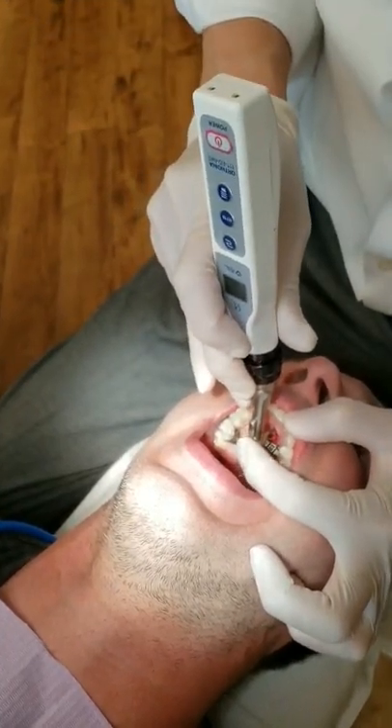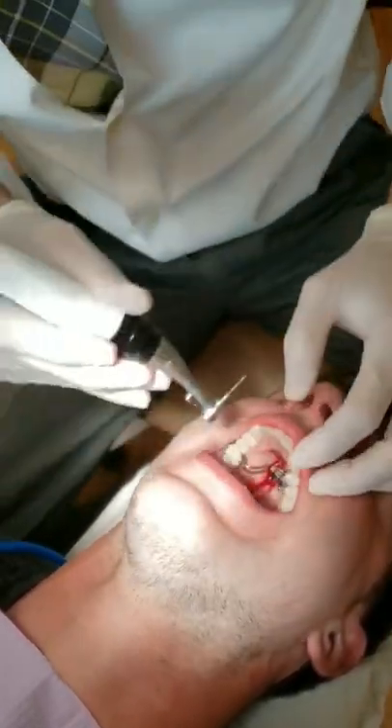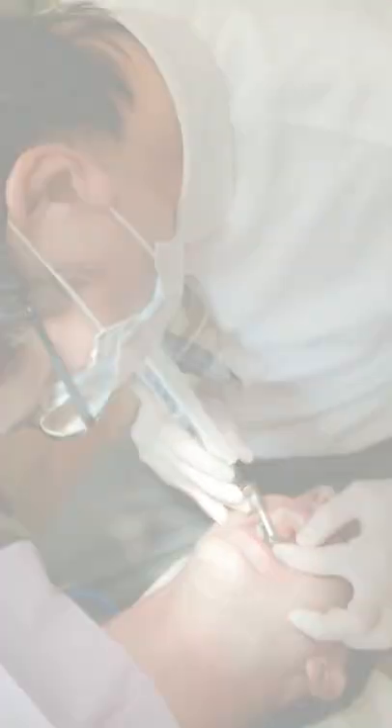We don't want to do it too close to the nasal spine. You can also see the angle of my handpiece — I don't angle it that way because you might go too close to it. I just finished the corticopuncture procedure.